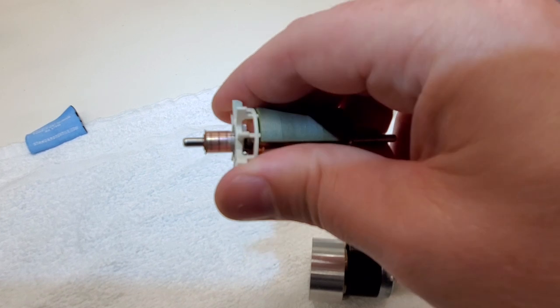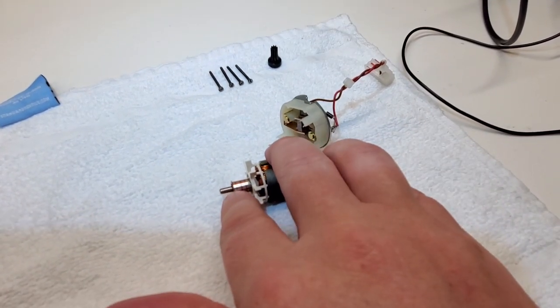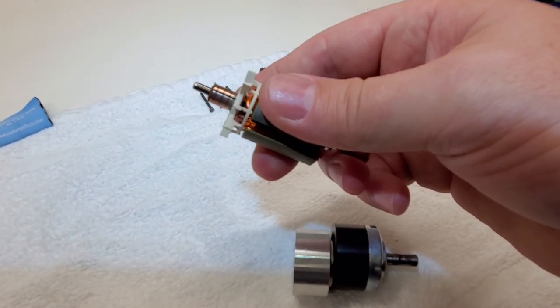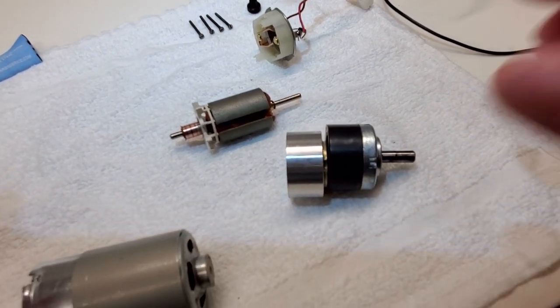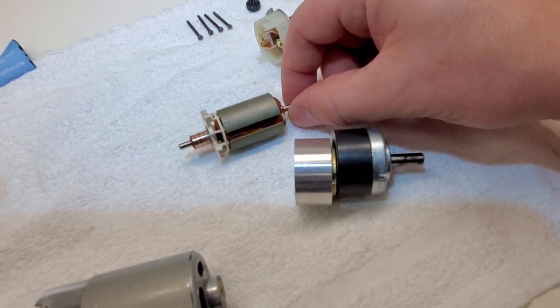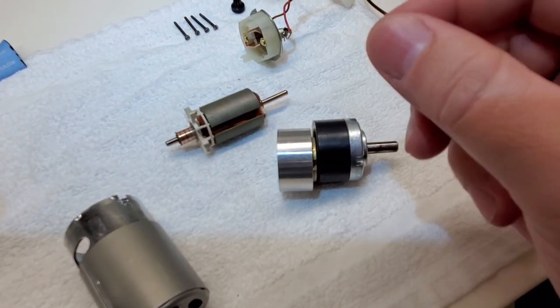So you can see right there on all my commutator bars, there's no conjunctions, because sometimes you get a bridged commutator bar because of long time wear and tear on these motors. And none of these are bridged that I can tell. They're all very separate. It actually looks really good. That's not the problem. The problem partially is probably the grease of the planetary set. It's old. And also the tolerances on those bronze bushings, these guys right here, are a little bit out. It weeble wobbles in there a little bit.